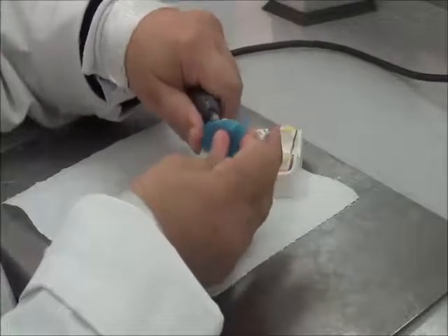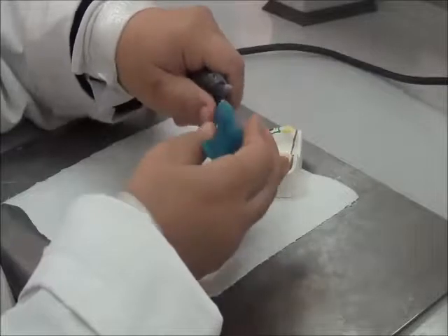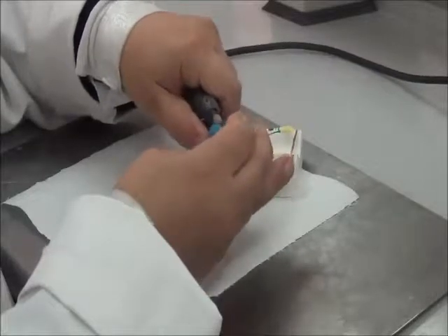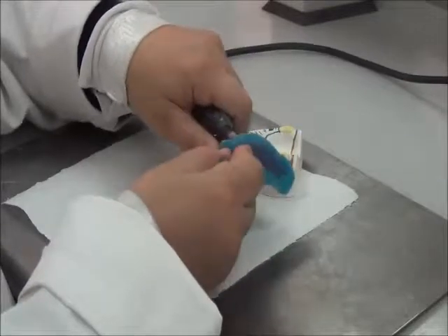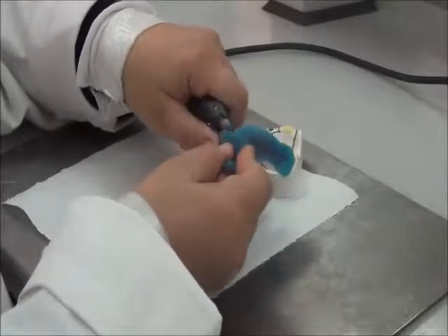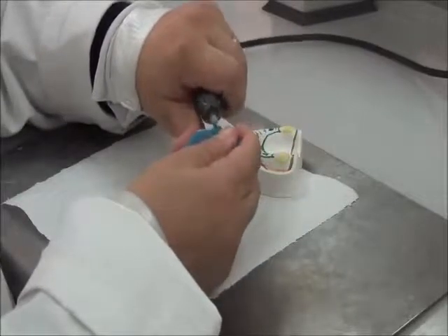Further smoothing the surface, going around the border from the upper side, going into this notch and smoothing it, and making sure that all of the edges are not sharp.